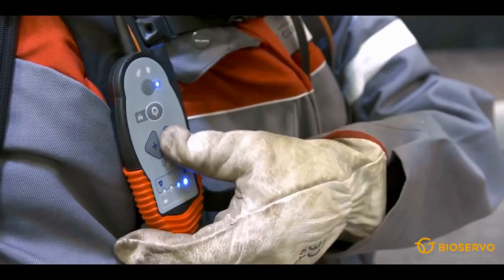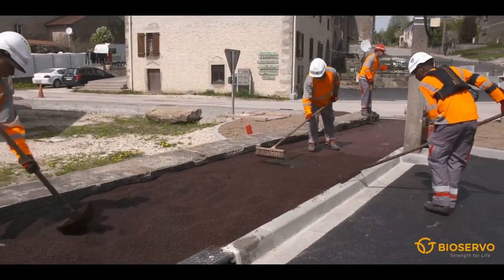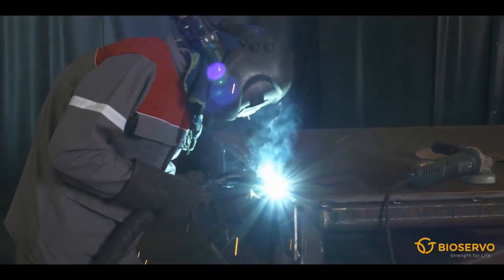In many industries, tools and power tools are held static for a longer period. Ironhand relieves the muscles, reduces the fatigue and increases the productivity.